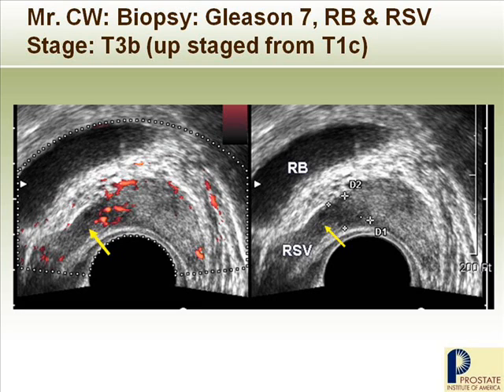As you see in the black and white study, there's a dark spot along the right side of the base, a fairly large-volume dark area. Color Doppler shows that the dark area gets quite a lot of blood flow. So it is quite suspicious that it is indeed his cancer site. Take a look at the next slide, the side view, which shows the base level of the prostate. Again there is a dark spot with increased blood flow, but it is awfully close to the seminal vesicle.